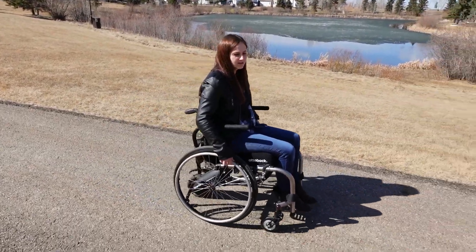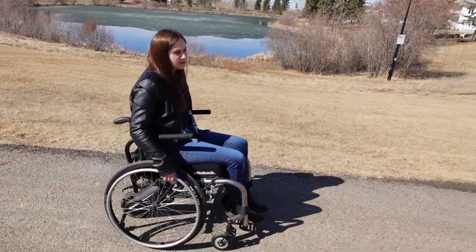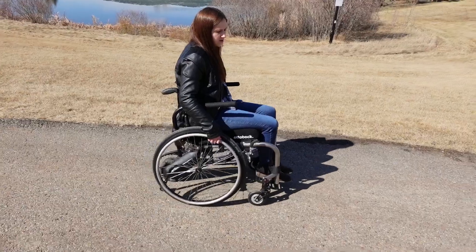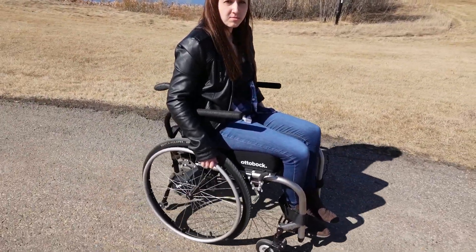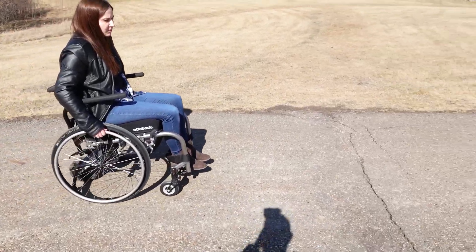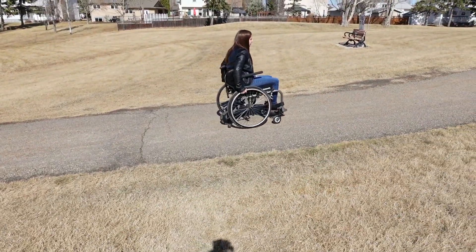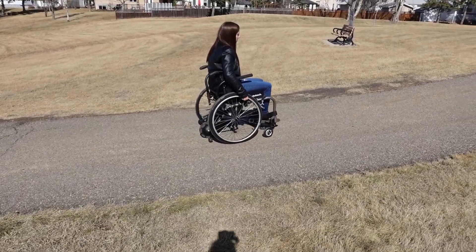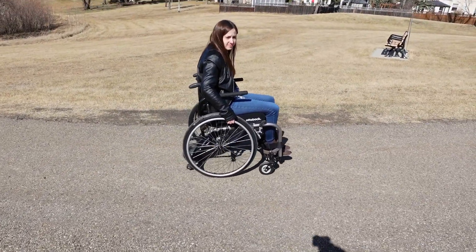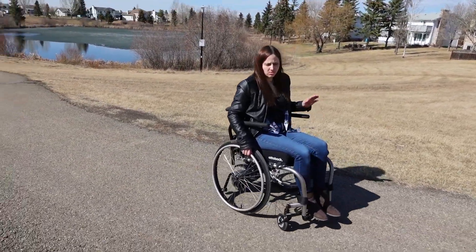I did turn it down for safety purposes. Essentially you tap once and you're locking your speed, so I'm locked right now. It still goes fast. You can set that speed. So you just use the watch, you sort of set it with the unit, and then you just tap your leg. This is pretty impressive — this is going uphill right now, Bill. I'm not even helping. I'm just holding the hand rim so I can turn myself. That's pretty neat — I can still propel myself, because the thing is so light and it just free rolls. Or you just let the unit do it. You can also turn it up depending on if you're with family, friends, or kids.